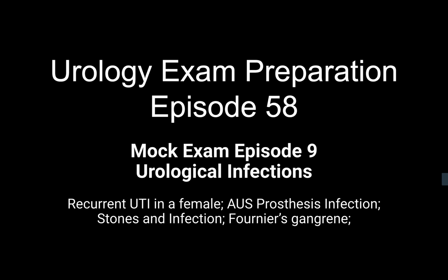What do you mean by the medicated implant? The latest implants come with a pre-medicated coating such as... sorry, I'm not exactly sure what the antibiotics are. So it's antibiotic coated. Okay, what implants do you normally use for artificial urinary sphincter?